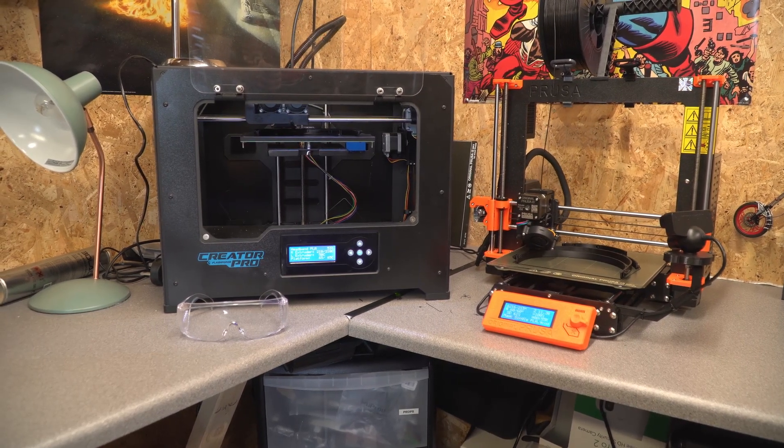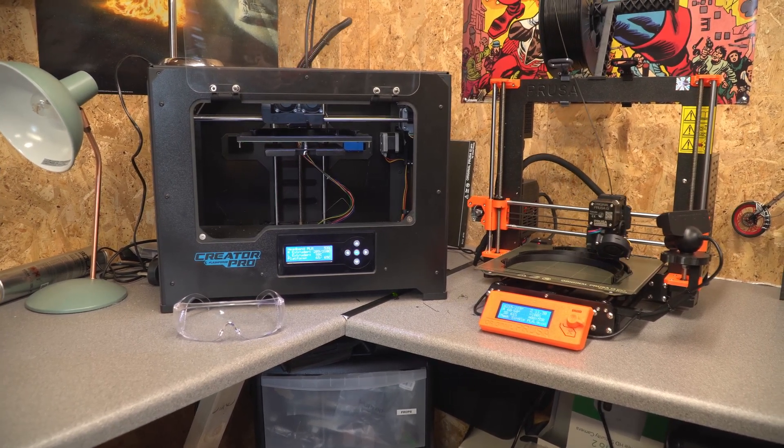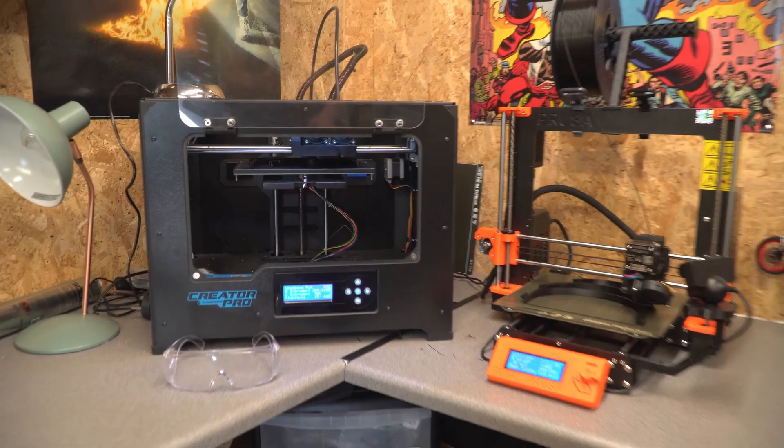I was originally doing these in PETG, however I've now run out of PETG and had to move on to PLA. Both materials are currently being accepted over here in the UK.